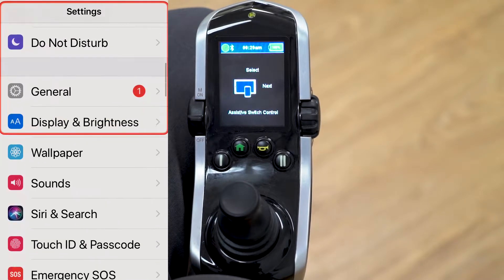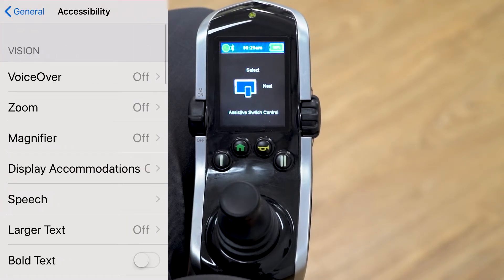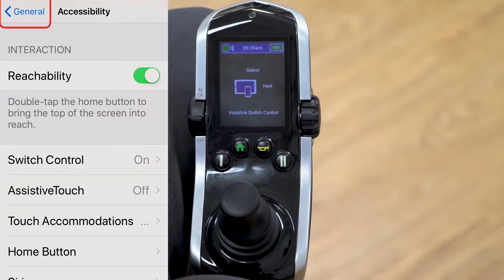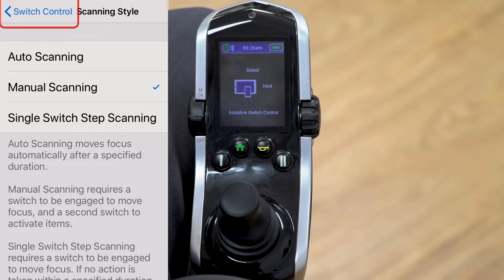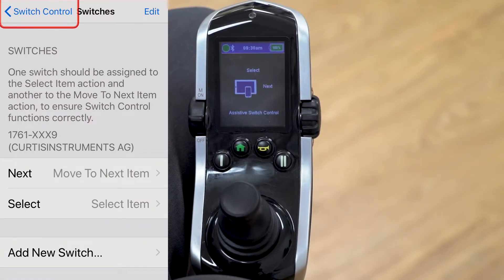Next, go down to general settings, then accessibility, and enable switch control — you can see on the phone that switch control is enabled; as soon as it connected, it turned itself on. The scanning style is currently set to manual scan, which is the preferred setting for the best control over the iPhone, so we'll leave it as manual scanning and go to switches.